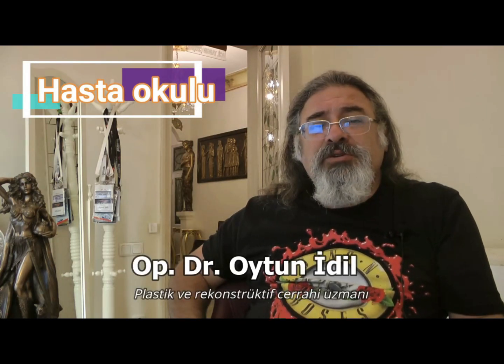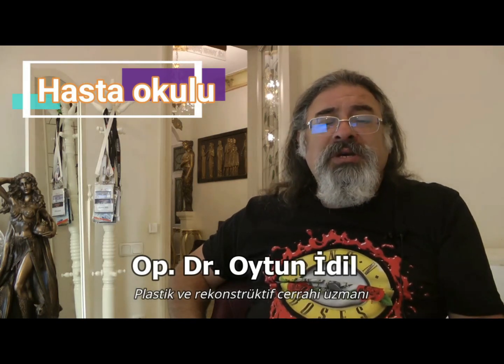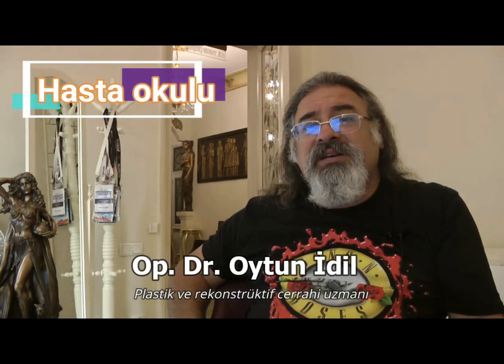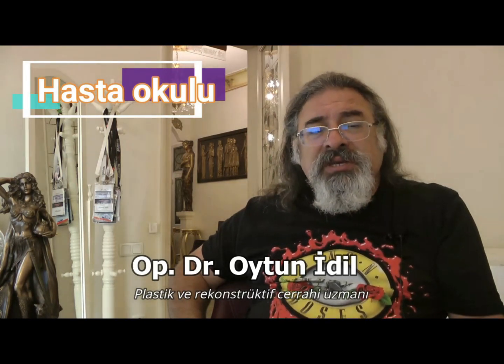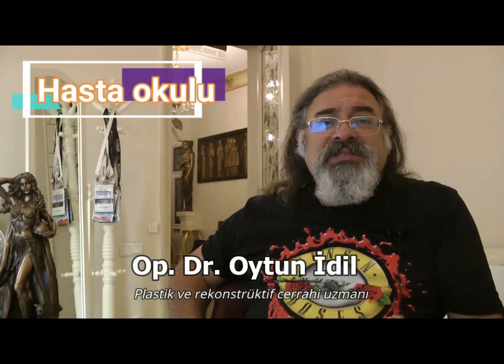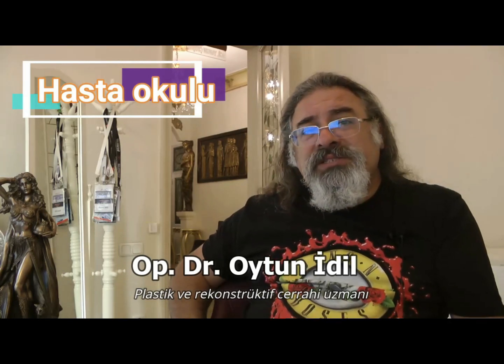One of the male genital surgeries that we perform frequently is testicle prosthesis surgery. In some cases, one of the testicles of the patients may have been removed during childhood. How can this happen? The child could have been born with undescended testicles. If it was left in the inguinal canal, it is removed because the possibility of it turning into cancer at later ages is high. So one testicle of the patient falls short.